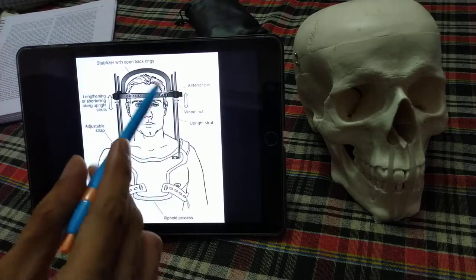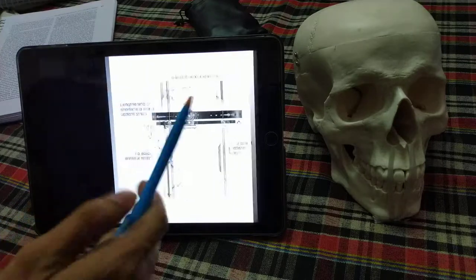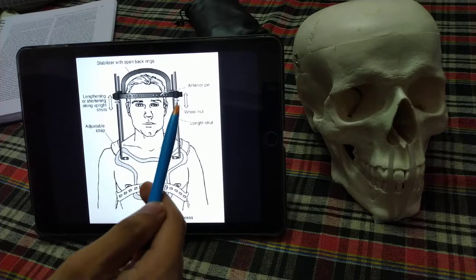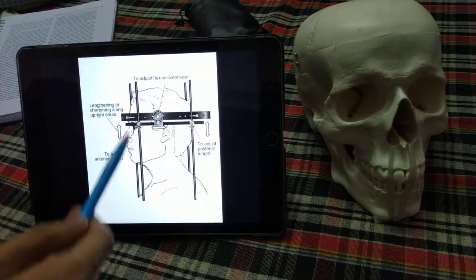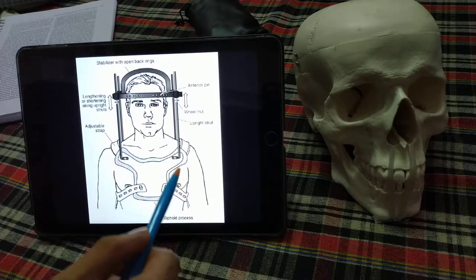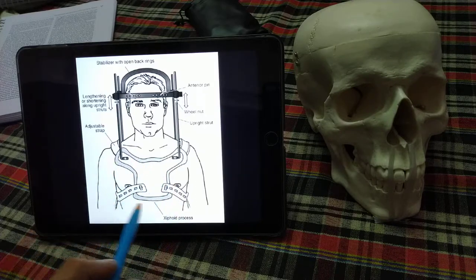The second component is the pins — there are two anterior pins and two posterior pins. The placement of these pins will be discussed later. The third component is the struts — two anterior and two posterior struts. These struts attach to the distal part of the orthosis.